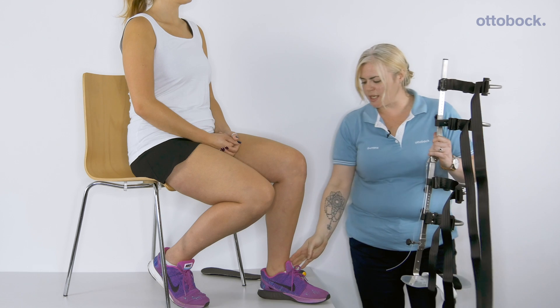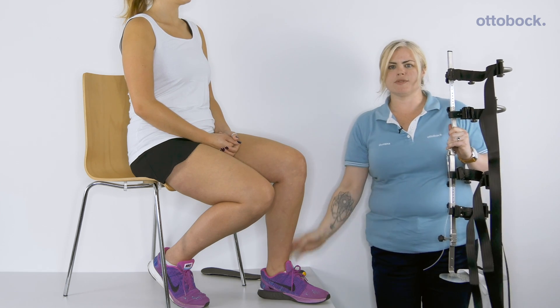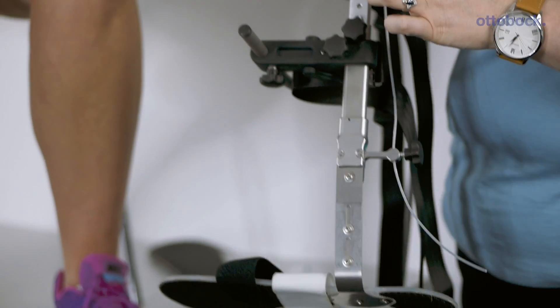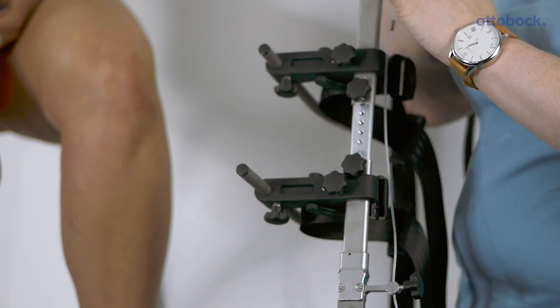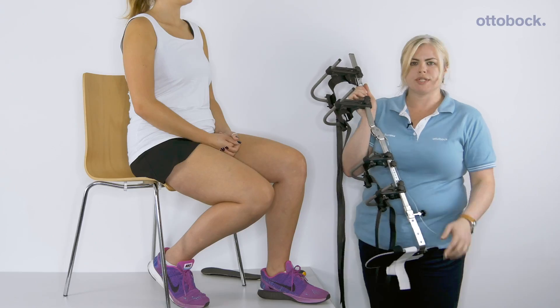First of all, you will measure the malleolite height to floor and knee joint center to floor. You will then adjust the test orthosis on the cross head screws and the side screws so that they link with the mechanical knee joint and ankle joint centers.